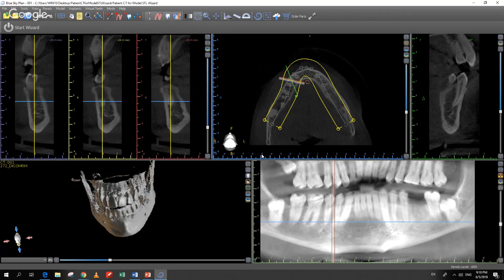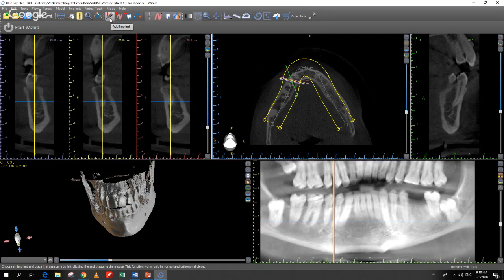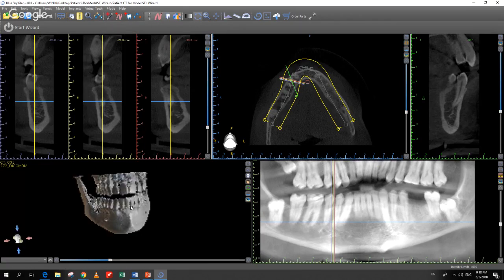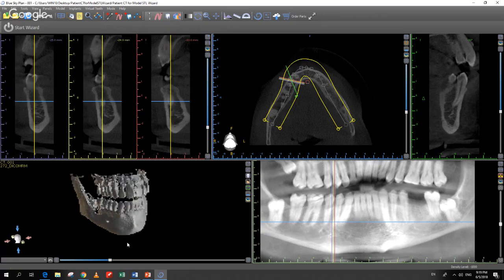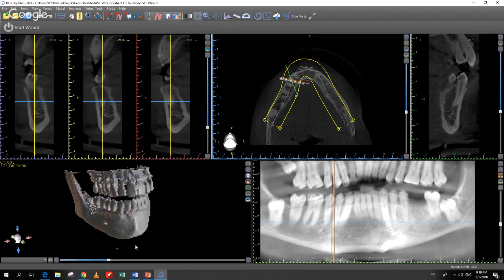Let's drop in an implant to demonstrate more software functionality. In the horizontal toolbar, buttons with a red plus — Add Implant, Add Nerve, Add Tooth — add elements to the case. The same icons without the red plus toggle visibility on and off. So buttons with the red plus add elements; buttons without it show or hide them.